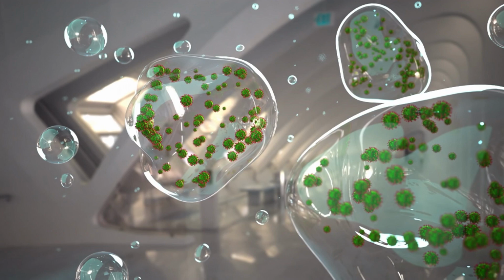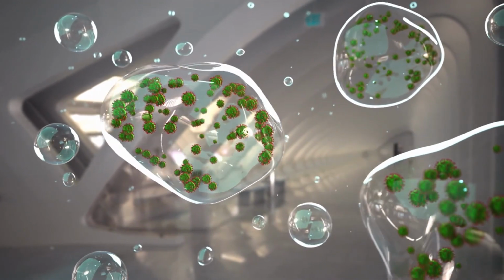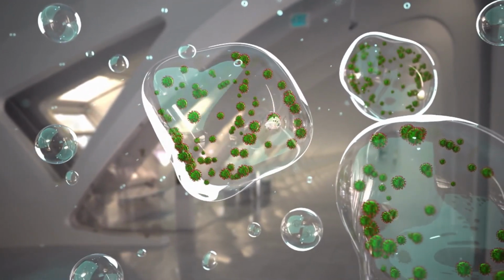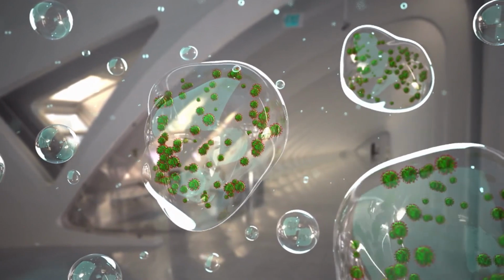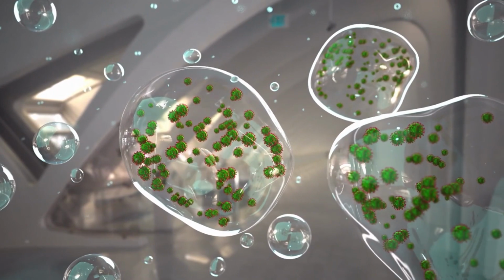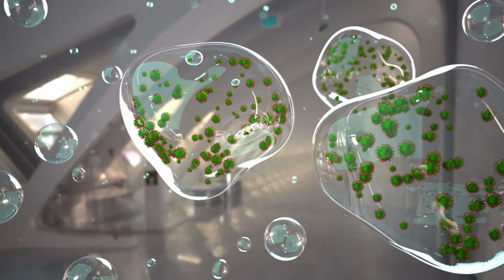When we think about utilizing armamentarium that generates the lowest aerosols possible when delivering restorative or hygiene procedures, it is really important to have that consideration. When we think about evacuations, we want to make sure that whenever possible we're using them to remove any airborne contamination before it escapes into the immediate treatment site. And we want to minimize the number of people in the operatory.